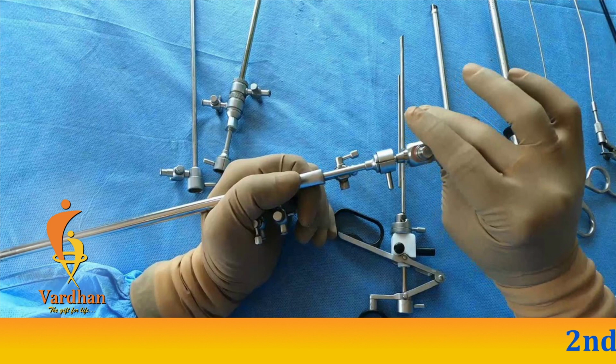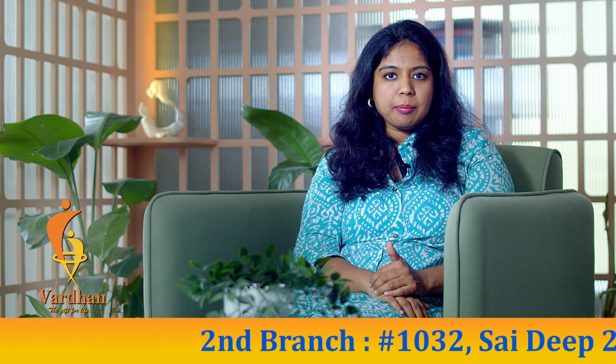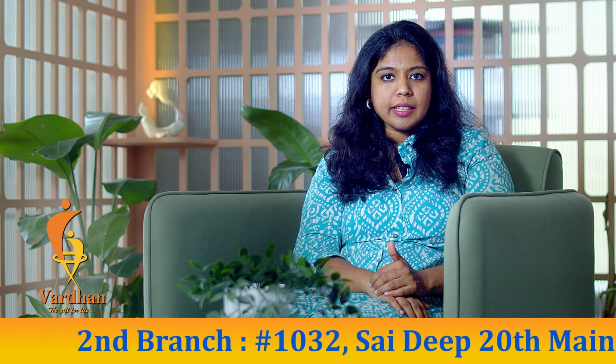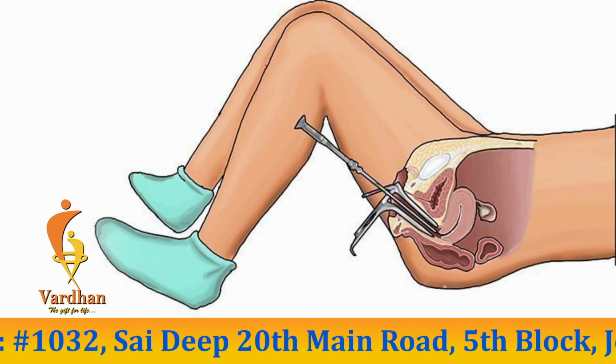So now I'll talk about the procedure. First of all, it's a daycare procedure. It is a minor procedure. The patient is expected to come to the hospital on an empty stomach, and then we would be giving sedation to the patient, and the patient will be put to sleep. So there will be no pain during the procedure.